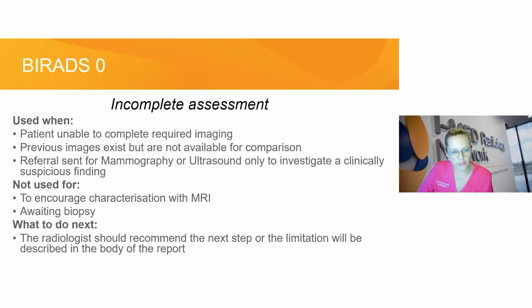When we know previous images exist but are not available for comparison at the time of reporting. Now, this is something that varies between radiologists. Some of us will report on the day and come back and do an addendum when we have additional imaging. So this is when that will get used. The reporter will put out the report that will say, we're retrieving the priors from another provider, but they're not available right now. So I'm going to call it BI-RADS 0, but I'm going to do an addendum when they're available to me. Alternatively, some radiologists will hold the report and not release the report until the priors are available for comparison if we know they're coming.